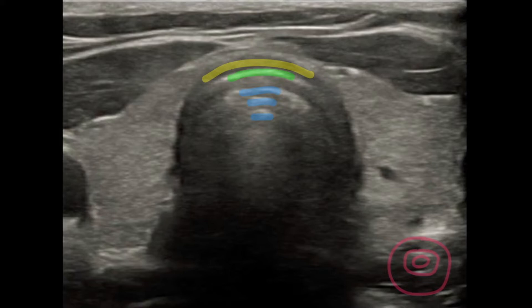And then the esophagus. The esophagus is probably more important if you're actually using ultrasound to guide your intubation, like during your actual intubation, in case you are worried you're going to misplace the tube. It might be a little bit less of a problem now with all of our video laryngoscopy. But the esophagus normally lies to the left of the trachea. There are some anatomical variants, so you're not always going to see it. Sometimes the esophagus is posterior to the trachea and all of that air just kind of obscures it. Or sometimes in very few cases it's over on the right. So if you don't see it, not a bad thing — sometimes it's just hidden.